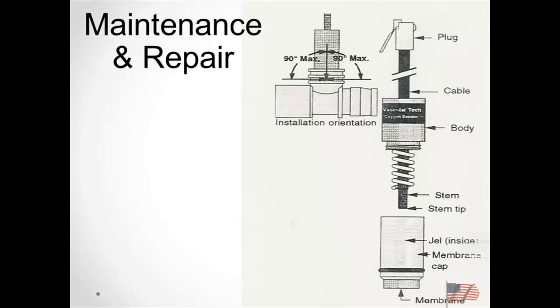Here's kind of a little more in-depth view of what the sensor looks like. We talked about this membrane that the oxygen has to dissolve and move across. There's a cap, then, with some liquid inside, some electrolyte solution. They call it gel here.